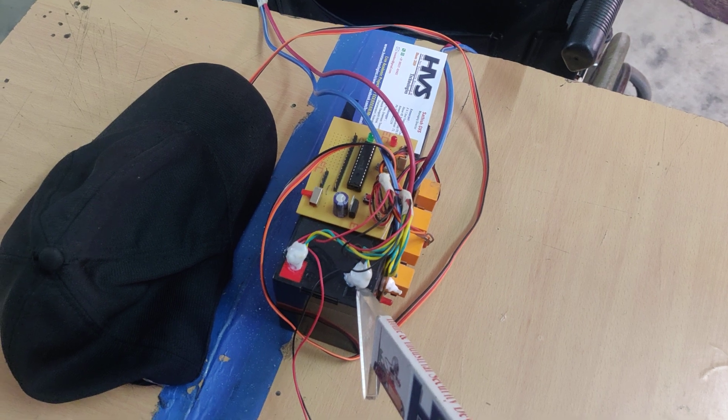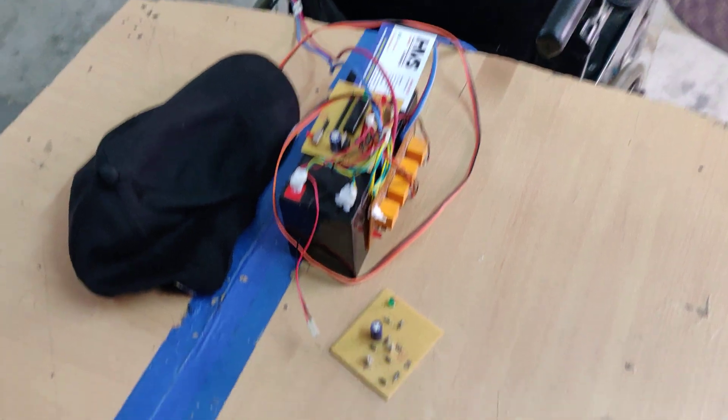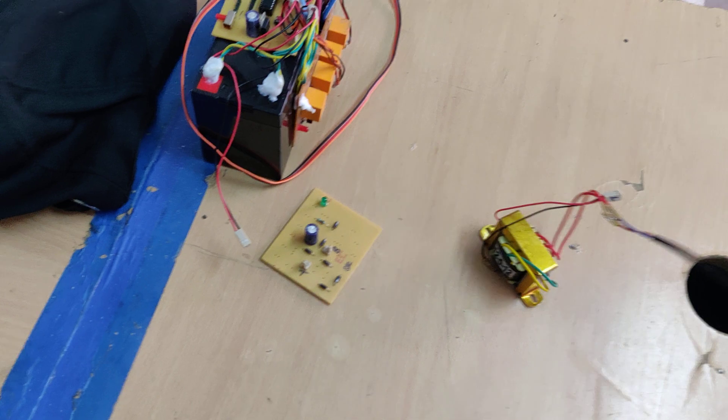The whole system is driven by a 12-volt, 7-amp-hour rechargeable battery. In order to charge the battery, we use this charger — we connect the cable to it and plug it in.